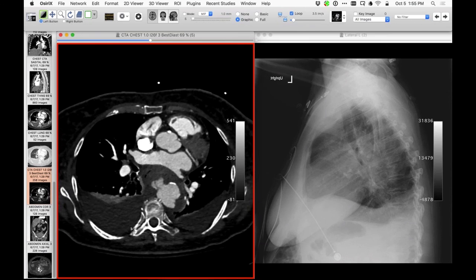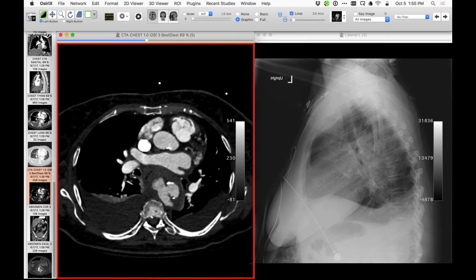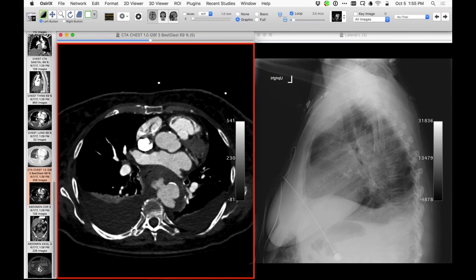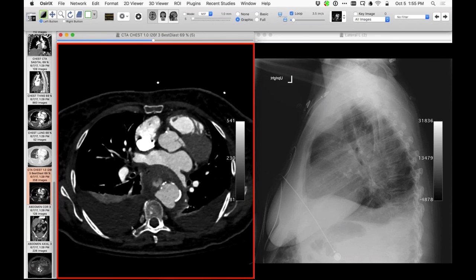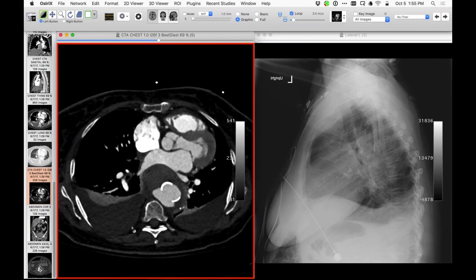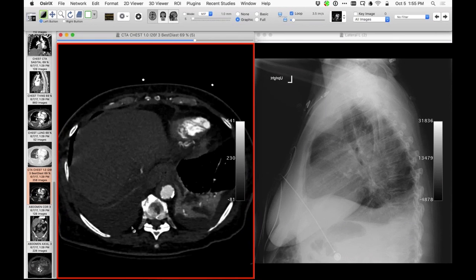And Leif showed me this case, so thanks to him for that. I think we presume that maybe it started off as a penetrating ulcer and went right through the wall and produced all the findings we see here. It's a great location for that, descending aorta. But just the most dramatic thing I've seen in quite a while. Yeah, that's really dramatic.